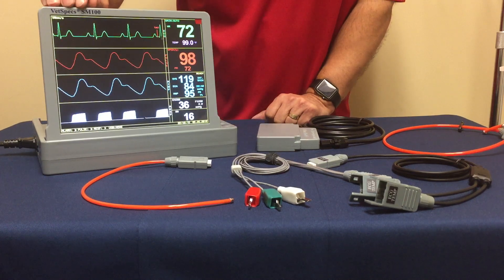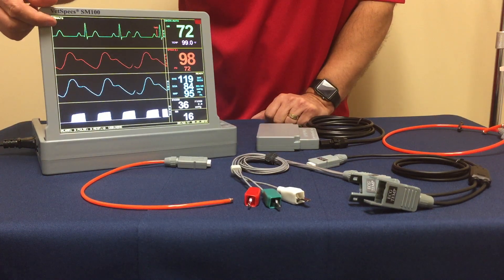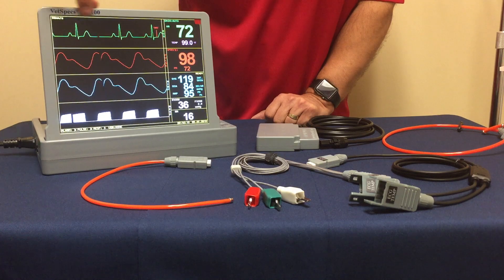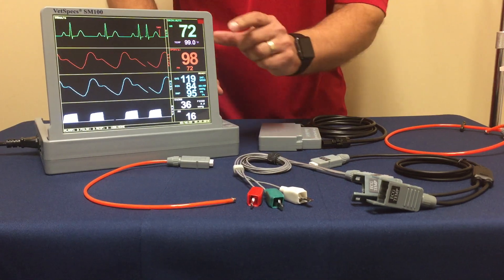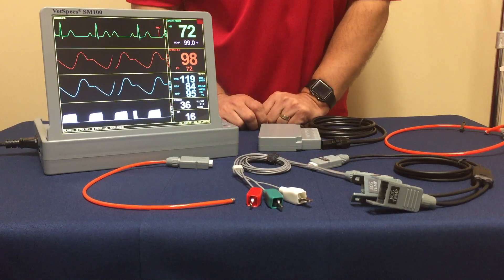If I could ask you to take a look at the screen, we're going to be focusing mostly on the top channel here: your ECG waveform, heart rate, and the temperature as you see in that top channel.